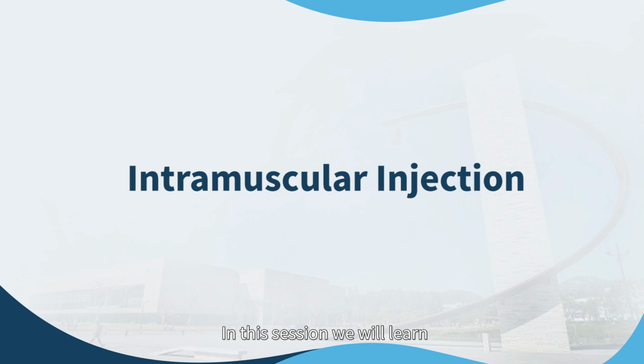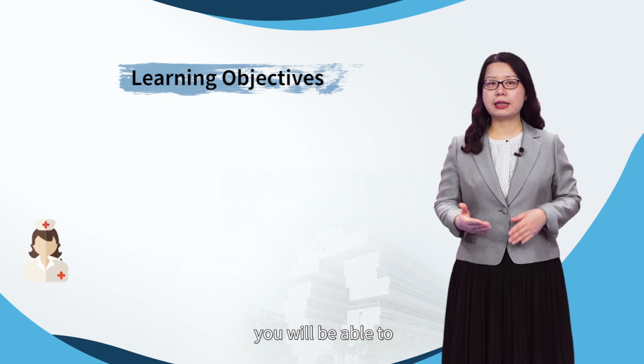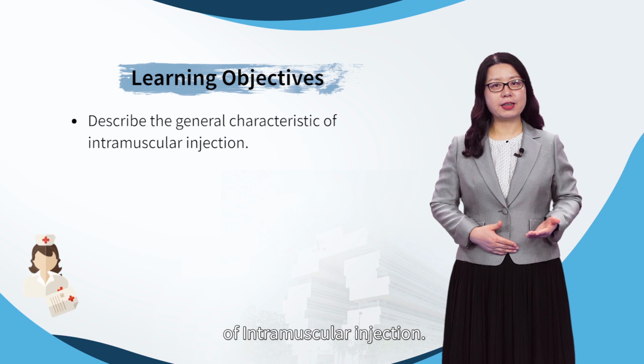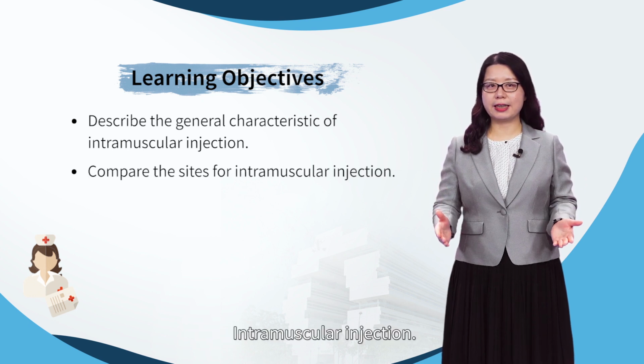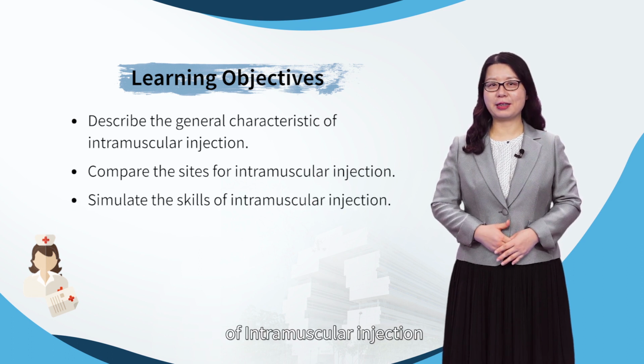In this session, we will learn intramuscular injection. It is abbreviated as IM. By the end of this session, you will be able to describe the general characteristics of intramuscular injection, compare the sites for intramuscular injection, and simulate the skills of intramuscular injection.